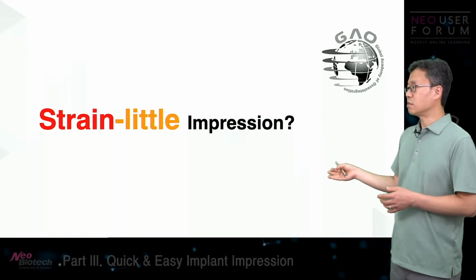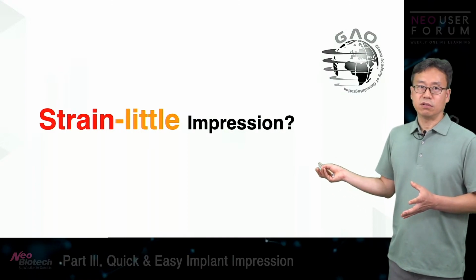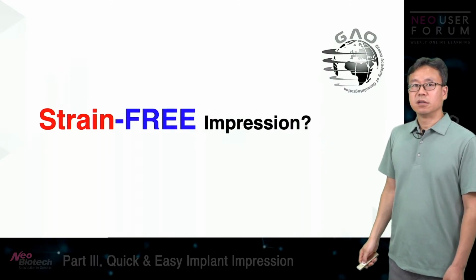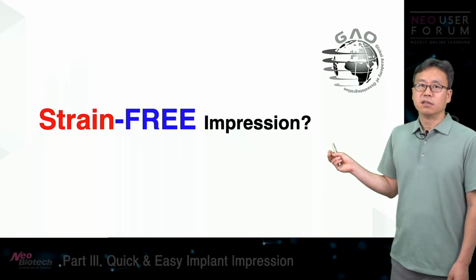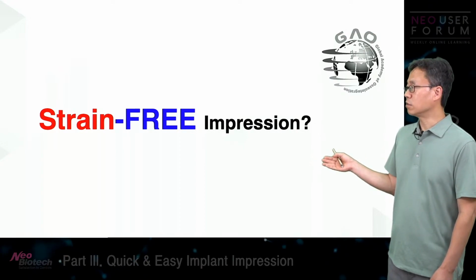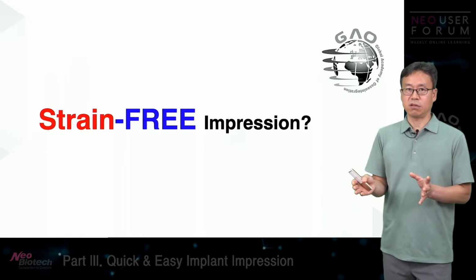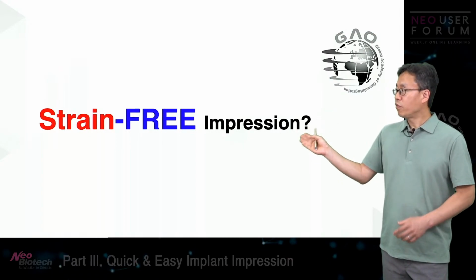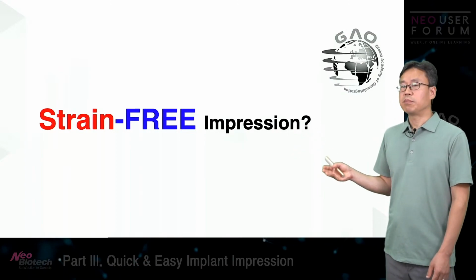We've just discussed that we should reduce strain during the impression procedure to minimize prosthetic errors. Implant prostheses are more sensitive to these prosthetic errors than prostheses for natural teeth because implants move much less than natural teeth. That's why we're interested in strain-free impressions. To do that, intraoral scanners might be the way to go.